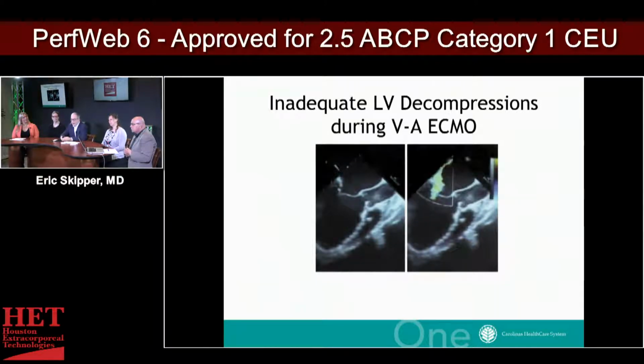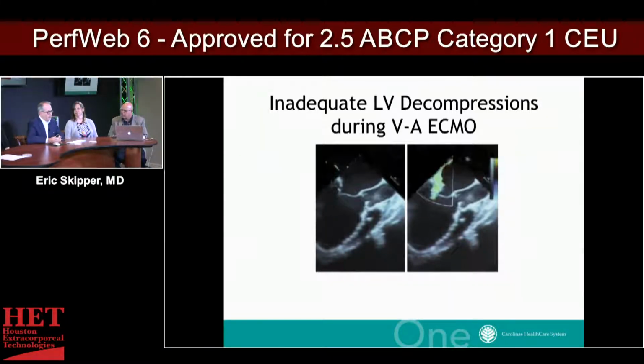Well, and honestly, a lot of these patients today come in with an Impella. Really? So they come in, they were intercepted at an outside hospital. That's what they have to offer in the cath lab there, so that's what was placed. And they may or may not put them on ECMO at that hospital. They may try to send them in as good a shape as they can without ECMO, or they may go ahead, after the Impella doesn't fix the problem, and go to VA ECMO. But then, yes, you would leave the Impella in.